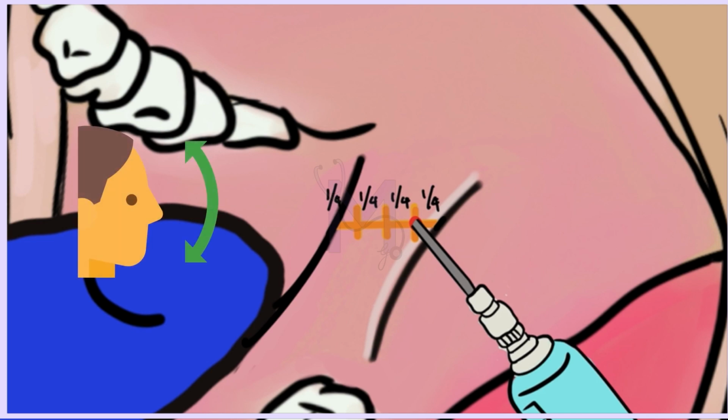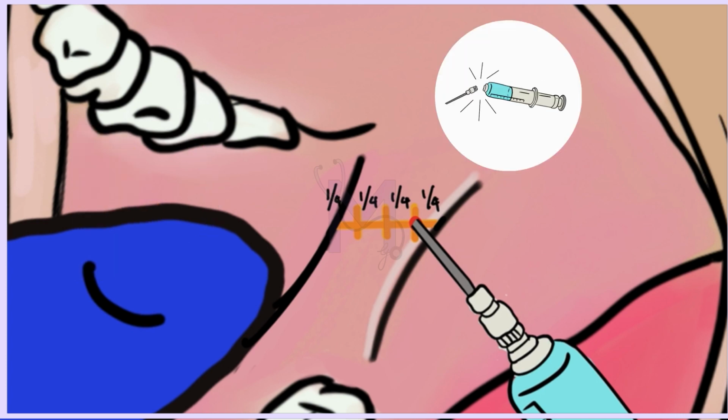A small portion of the needle usually remains outside the tissue, which is necessary because if the patient makes any sudden movements, the needle can break at the junction of the hub, which is easy to remove, as opposed to the entire needle being inserted or a very minimal portion being inserted.